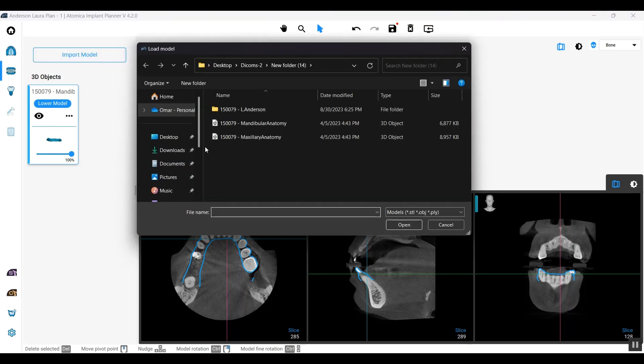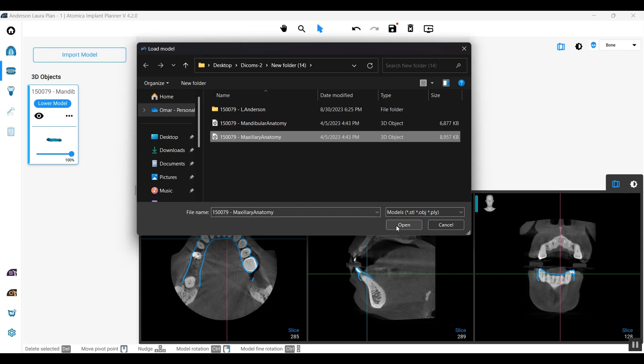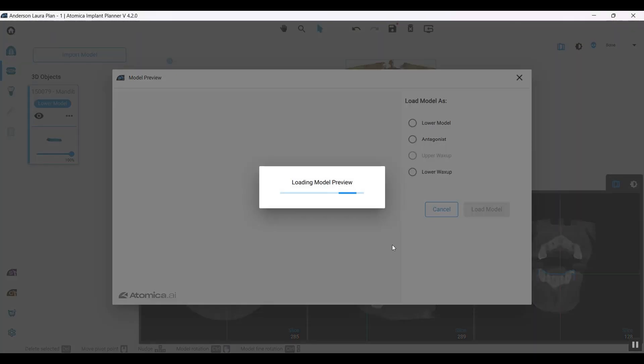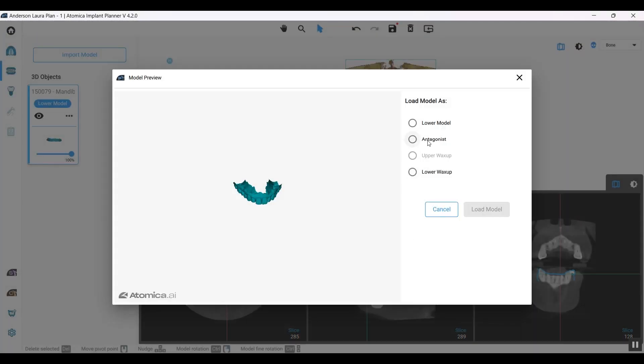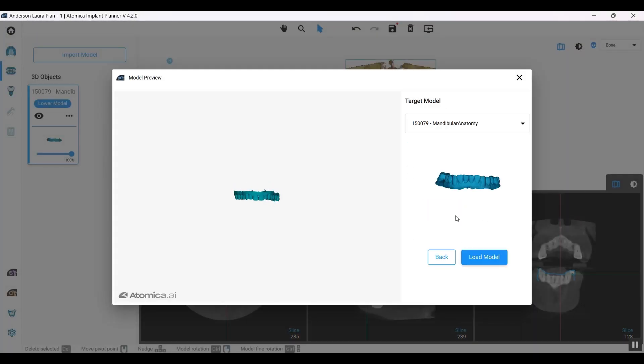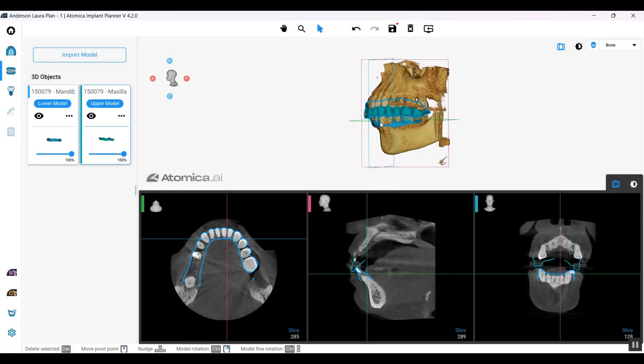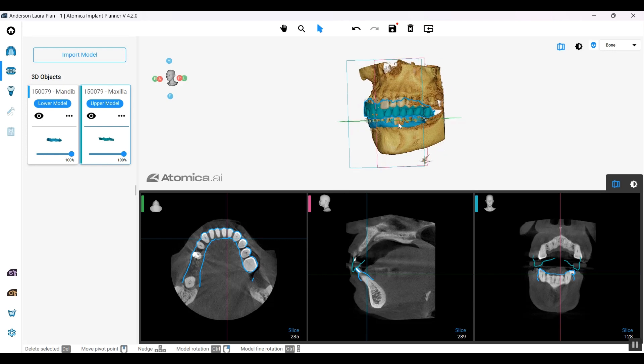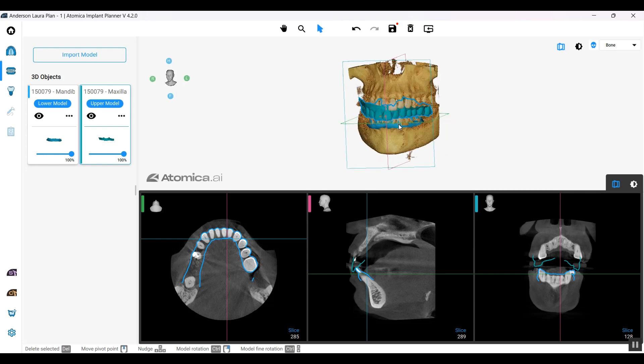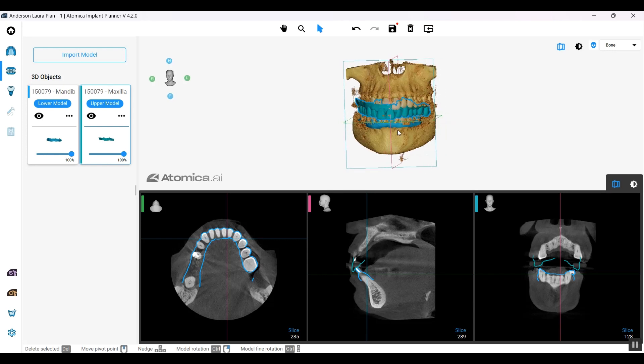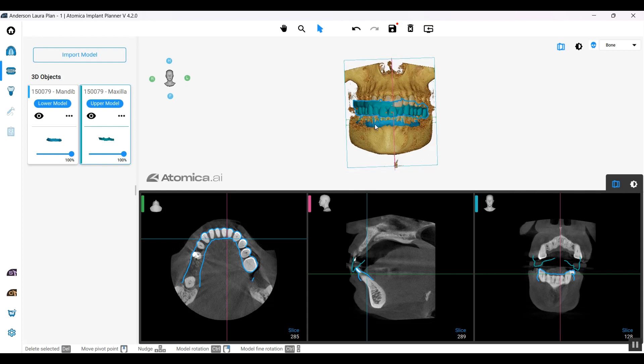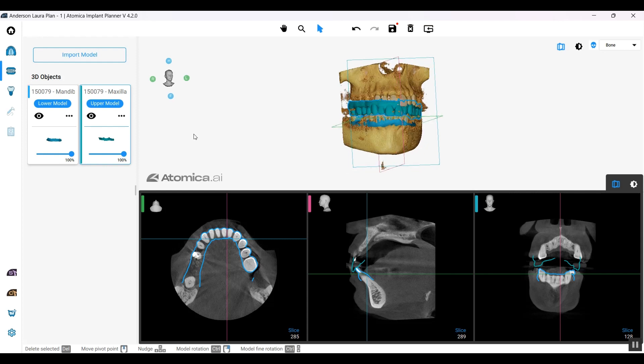You can also add an antagonist. Let's add an antagonist and make it relative to the lower model. If we selected a tooth in the upper arch and were planning on it, the upper model would definitely match with the upper arch of the scan as well.